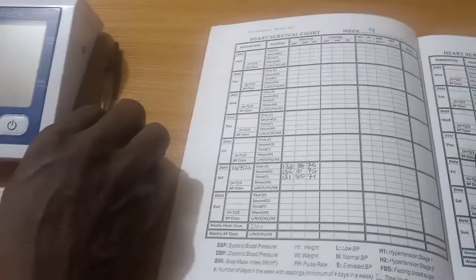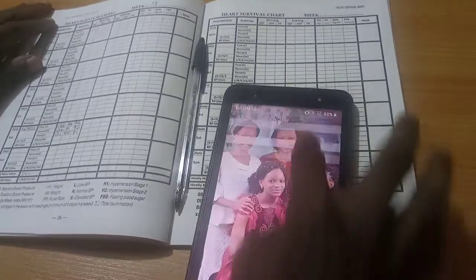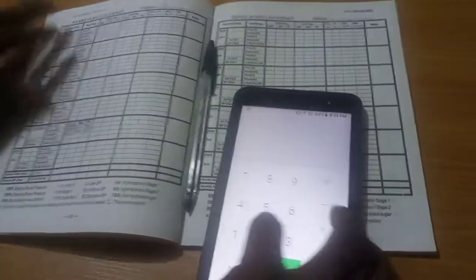Document the three sets of figures in the Heart Survivor Diary or other books dedicated for that purpose. Remove the cuff from your arm and keep the BP monitor in a safe location. Your main blood pressure is the average of the last two sets of BP readings — that is, the mean of the second and third BP figures.